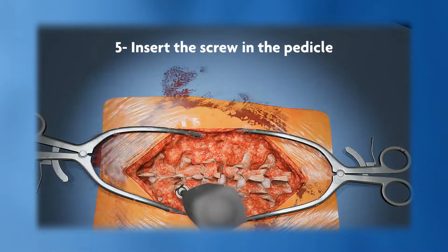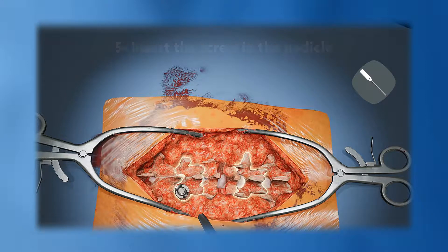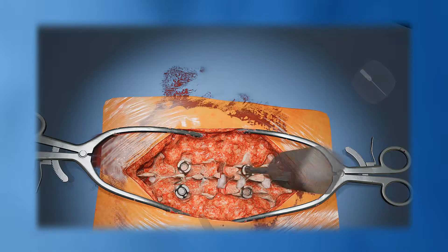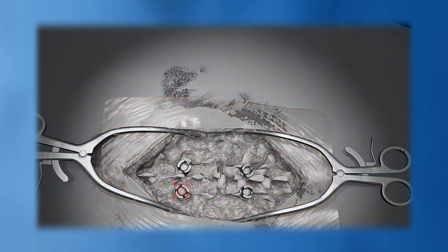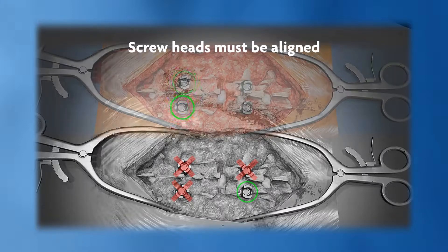Insert the screw in the pedicle using the screwdriver. Repeat these steps on every vertebrae targeted for fusion. When performing a three-level or more fusion, screw heads must be aligned for easier rod installation.